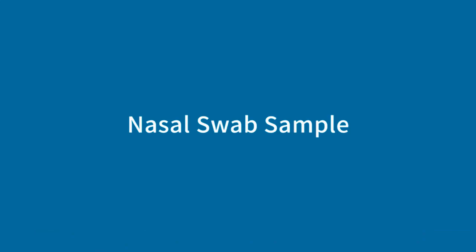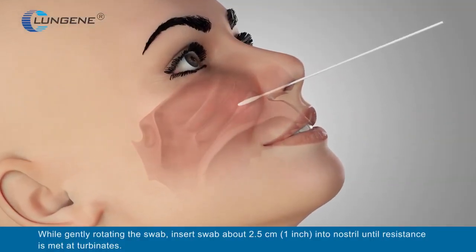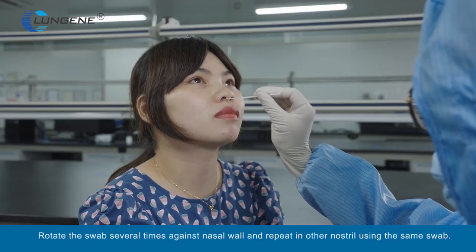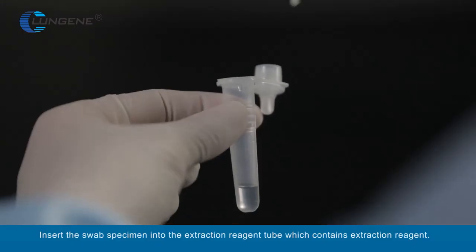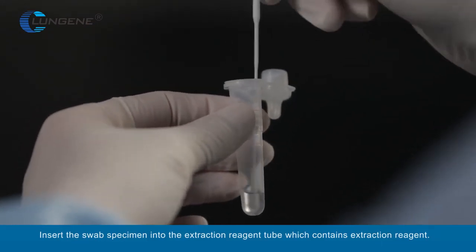Nasal swab sample. While gently rotating the swab, insert swab about 2.5 centimeters (1 inch) into nostril until resistance is met at the turbinates. Rotate the swab several times against the nasal wall and repeat in other nostril using the same swab. Insert the swab specimen into the extraction tube, which contains extraction reagent.